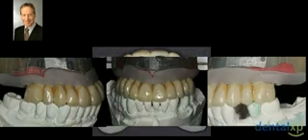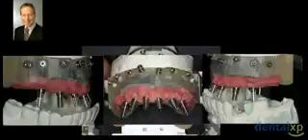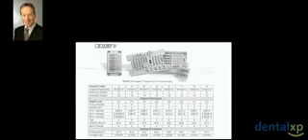So here we are now using all of these interrelated technologies, selecting temporary cylinders and abutments, which are going to be placed on conical abutments. And basically, all of the issues relative to the restorative regime are worked out ahead of time. You get your cheat sheet, and by this time, if this hasn't undergone due process, this does not mean anything.